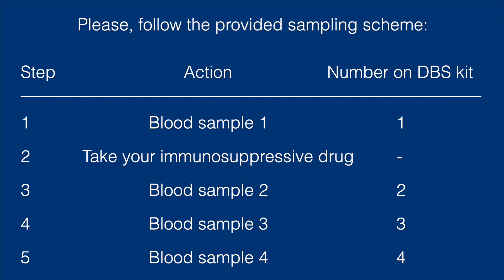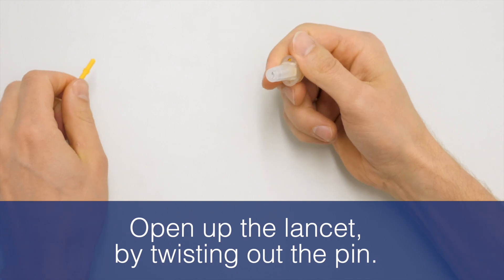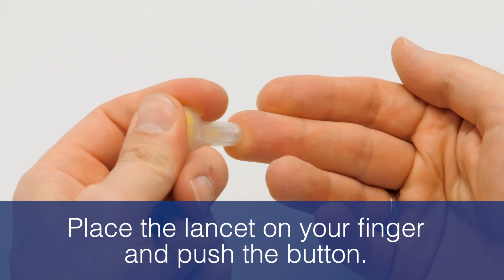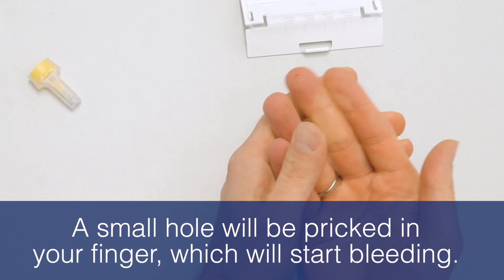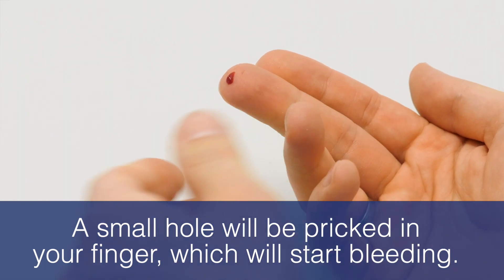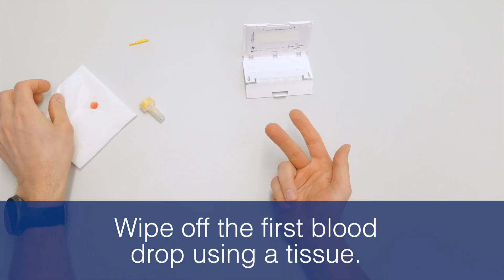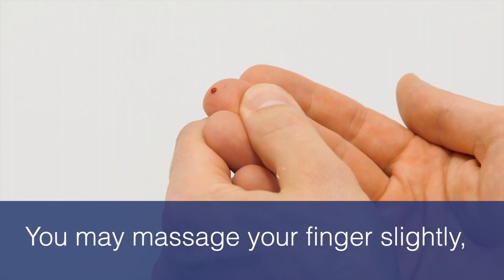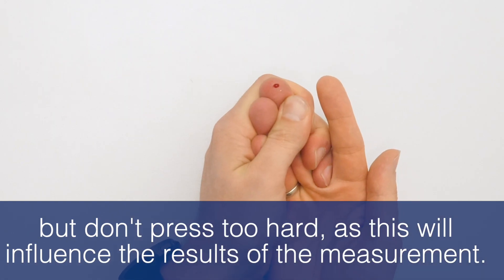Please record the time when you take your blood sample. Open up the lancet by twisting out the pin. Place the lancet on your finger and push the button. A small hole will be pricked in your finger which will start bleeding. Wipe off the first blood drop using a tissue. Wait until a fairly large second blood drop forms. You may massage your finger slightly, but don't press too hard as this will influence the results of the measurement.